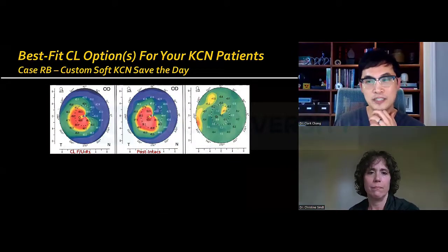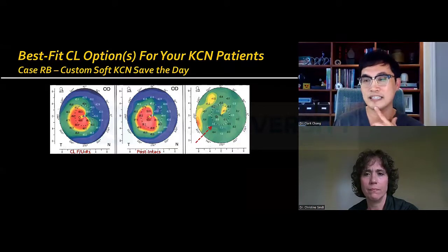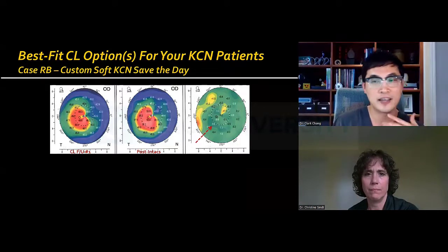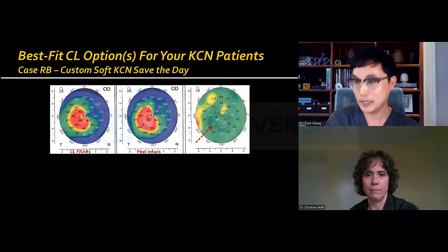So the patient saw really well, came back really happy, but noted that when he removes his lenses at the end of the day, because again, he's wearing them all day long, his glasses are now not as good. So, spectacle blur.